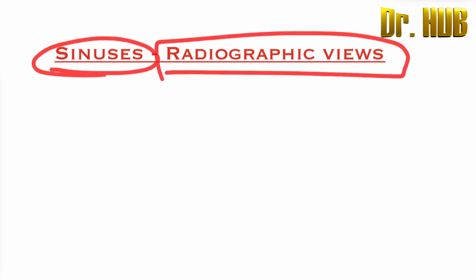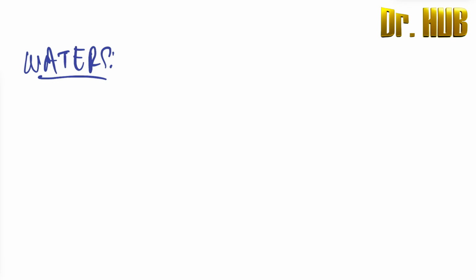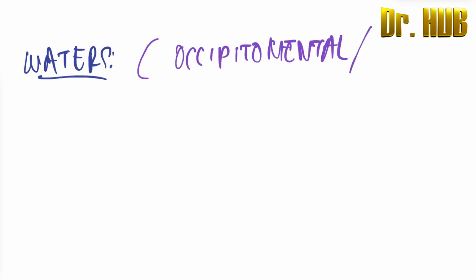Sinuses and their radiological views. First is the Waters view. The Waters view is also known as the occipito-mental view, or the nose-chin (NC) position.